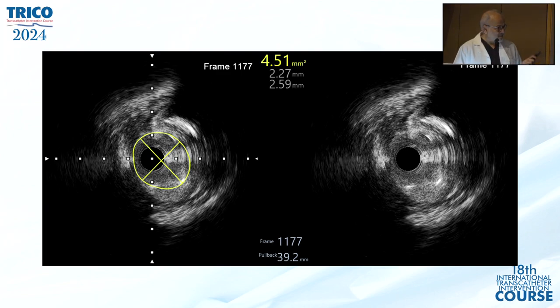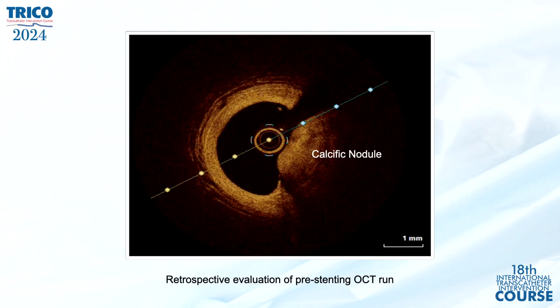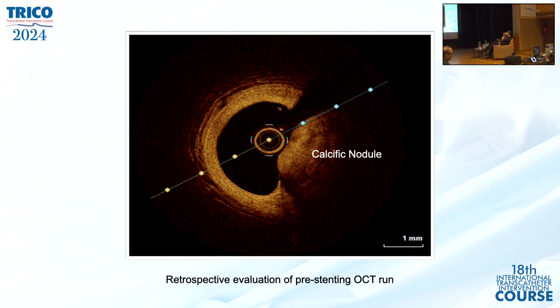Any comment by the panel? I think it's a very important point, and it's almost a discipline that you have to follow, where you step away for 5 minutes and look at the imaging results instead of doing it on the fly. Yes. And I taught that to myself after getting into trouble a few times by rushing through it. And this is the nodule, and unfortunately the previous OCT catheter was very flimsy, Optis. It simply did not go, but then I pushed the IVUS catheter, which showed this.